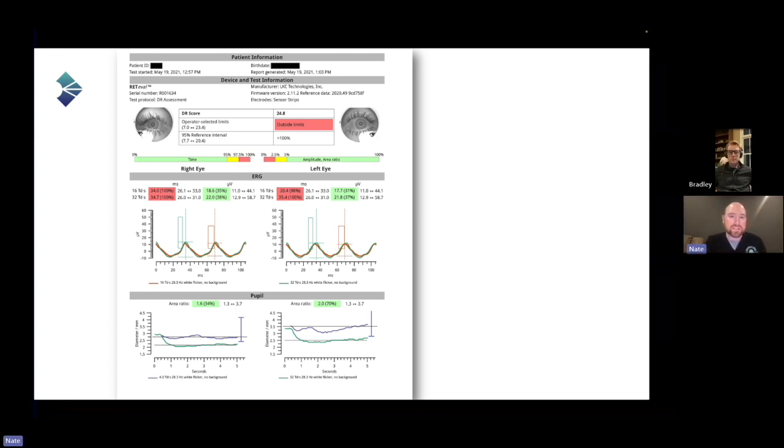Maybe you do an OCT angiogram. Maybe you do a visual field. You do more ancillary testing. You repeat your OCT and photos more often. Better patient education. You're going, all right, Mrs. Jones, we need to get this A1C that's 8.2. It's affecting the ERG, and we are seeing stress. If I told you your EKG was abnormal, that would concern you. I'm telling you your ERG is abnormal, and this is telling us we're going down a road that you and I don't want you on. And at the end of that road could be vision loss.